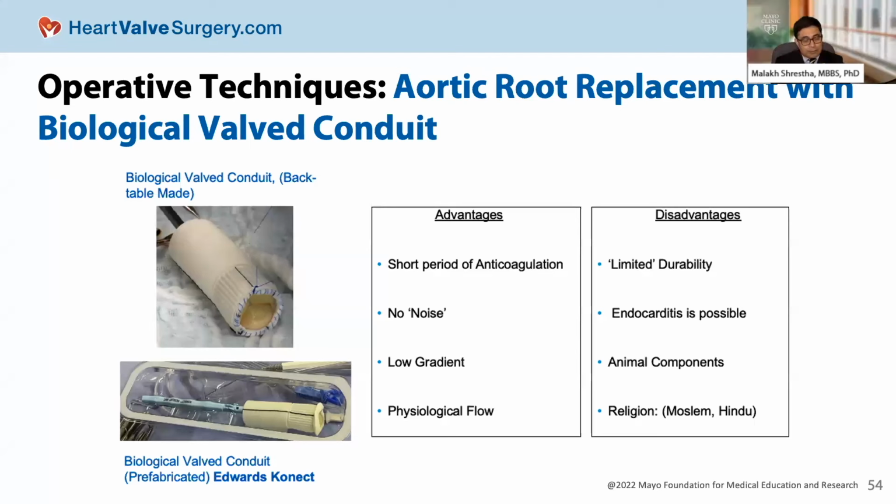Yes. Thank you for asking me the question. Actually, when we designed this valve, the reason it took 10 years, we started in 2007 and worked together until 2017, was that we specifically made sure that if this valve should fail, let's say in 15 or 20 years, then we can do a valve-in-valve. So this conduit has markers to make it easy for the valve to be put in. And the second thing is that most of the patients with this disease have a very large aorta. That means we are usually putting in large valves, 27, 25, or 29, so that later on, a valve-in-valve is not only a possibility, it makes it easier to put them in.